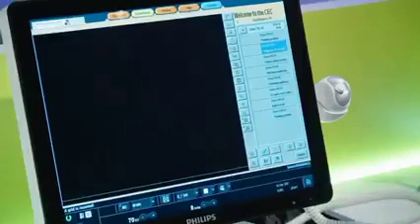So the system itself, with all the unique features, is one side of the story. But of course, the heart of the machine, where you do all the processing, where you set your generator, it's done here in the control room. The control room where we have the Eleva user interface. Eleva user interface within Philips, the common platform used on all our DXR systems. If it's a mobile, if it's fluoroscopy, or any of our DR rooms, the Eleva is the user interface where you do all the patient administration, where you do all the generator settings, but as well all the processing will be done on the exact same user interface.